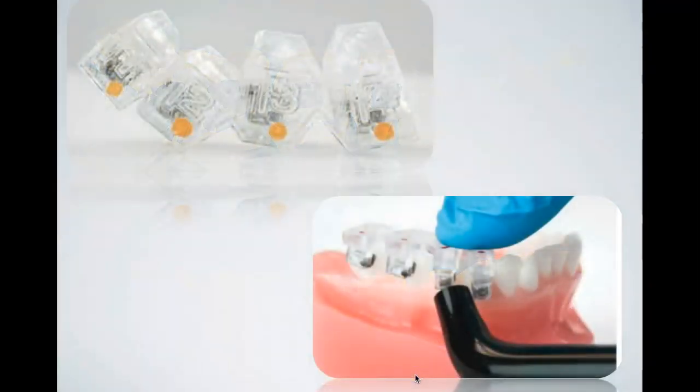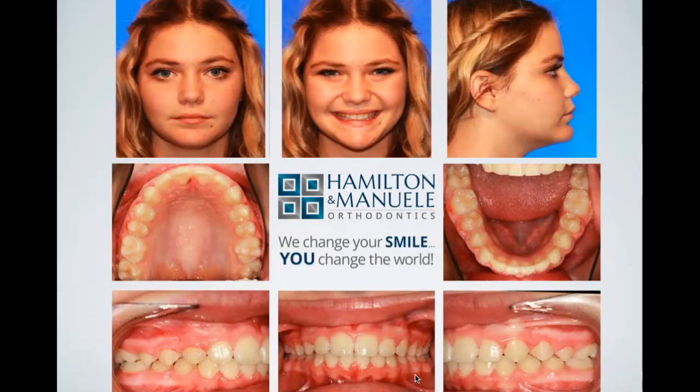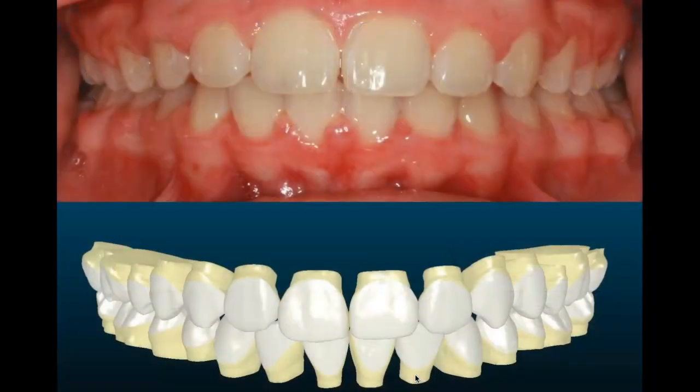So it was kind of a novel concept. It was really cool. You had these jigs. You could cut these jigs. If a bracket came off, you could put it back on. But practically, it was a little bit difficult. But it did allow us, this is my niece actually, that we treated her case. I think we got through her case in a little bit under a year, slight class 2. She wore some elastics. And when you look at where the setup was designed to be and where it actually finished, I mean, it is very, very accurate.